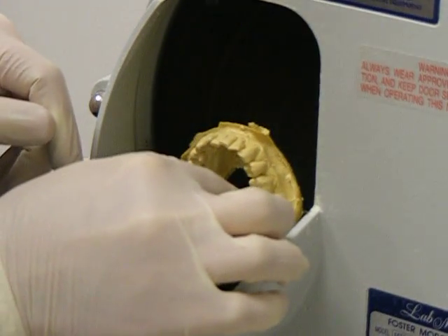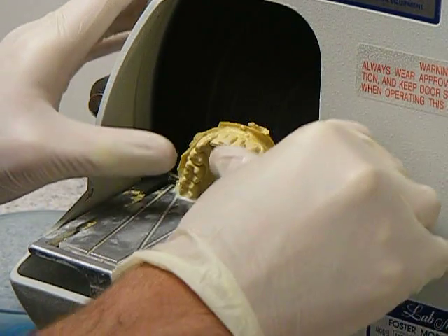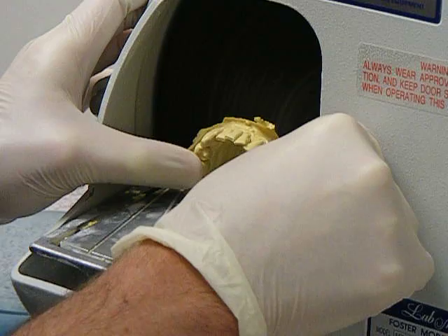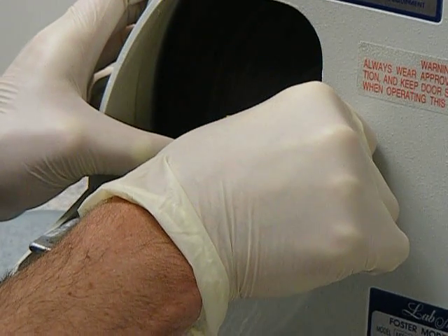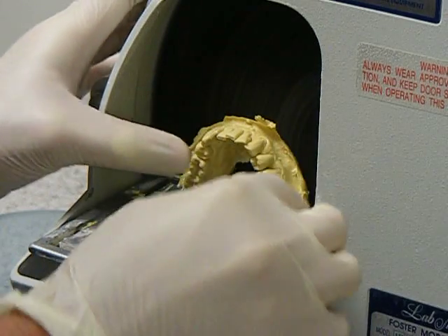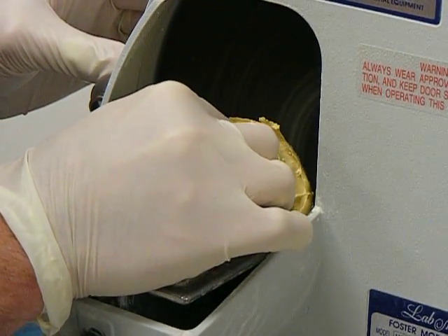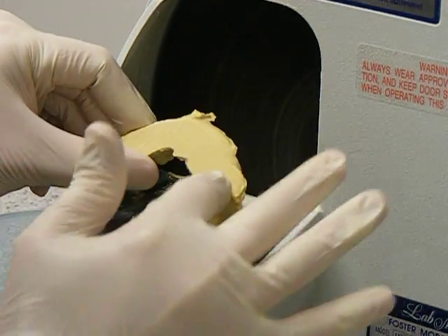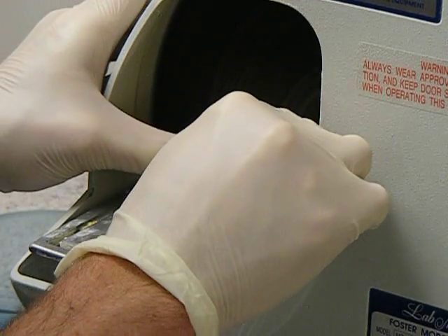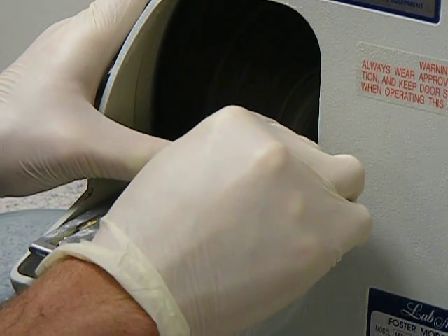Applying even pressure on both sides — a thumb on both sides — push it into the table. You'll see it's starting to grind off the bottom of the model very evenly and uniformly. The more pressure you apply, the quicker it will grind off.